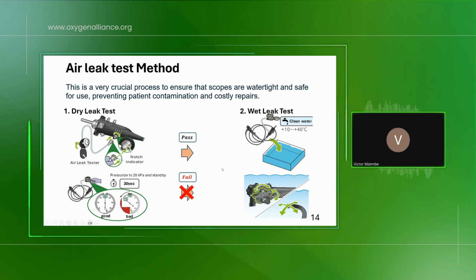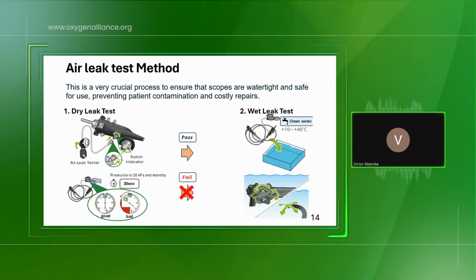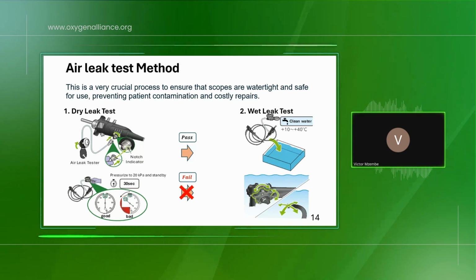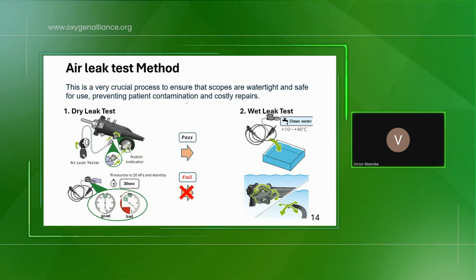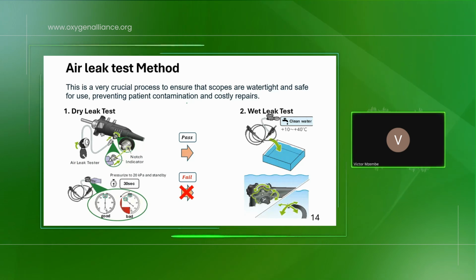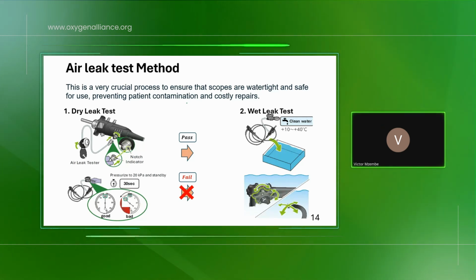All right. Thank you so much. Just bear with us, one more question and then we'll close. There's a question from Bernard. He's asking that he has an endoscope which has an angulation problem. So what would be the cause of this?